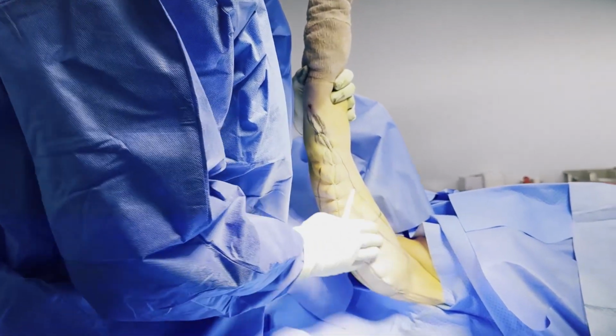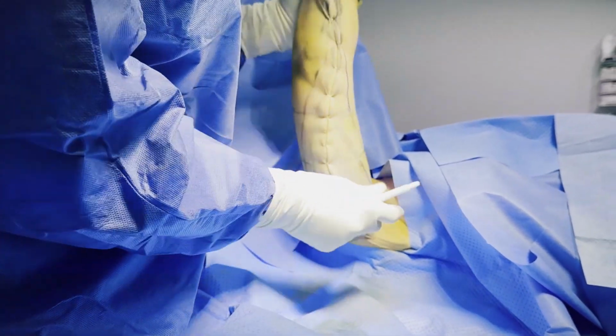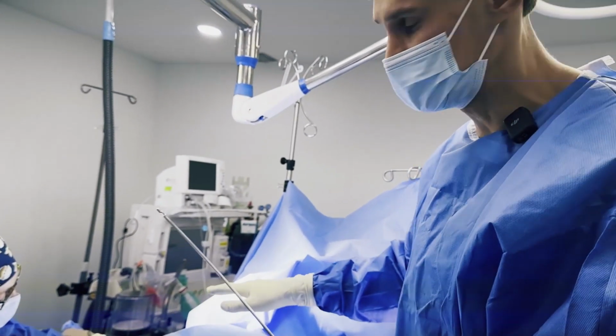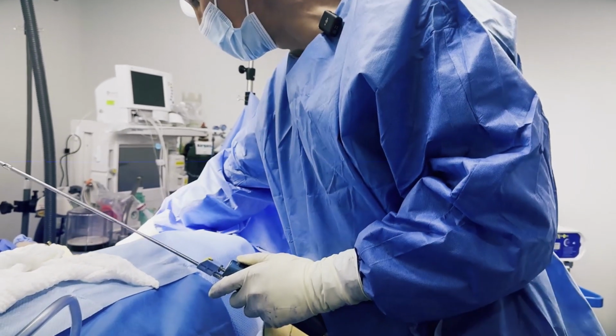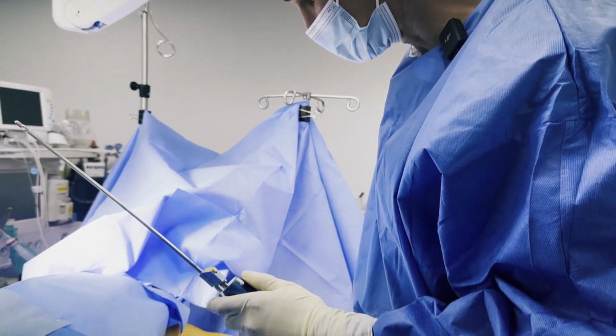She's doing good. Much better contour, you can see. Significantly improved contour, and we're just going to mark what needs to come out. So we are partially done with that arm. We start closing on that side. Looks nice and trimmed, and we start this arm full of fluid.